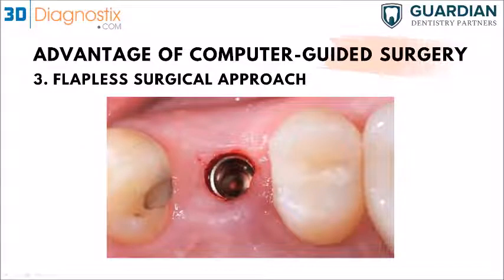So yeah, that is a recommendation. It might be difficult to do it through a punch. So most of the recommendation will be opening a crestal incision. It's not going to be with a vertical releasing incision. It's just going to be a crestal incision that you can have access to wedging the tissue, removing that part of the bone, and then suturing.